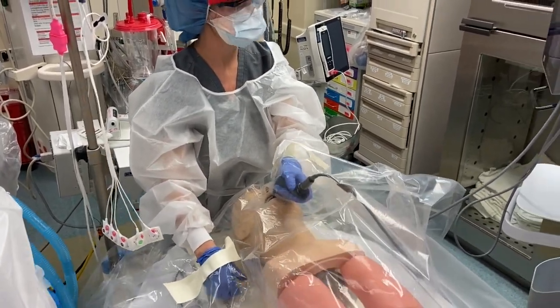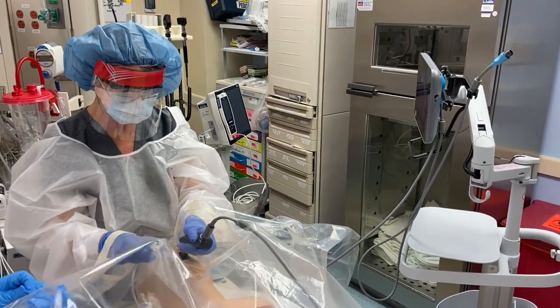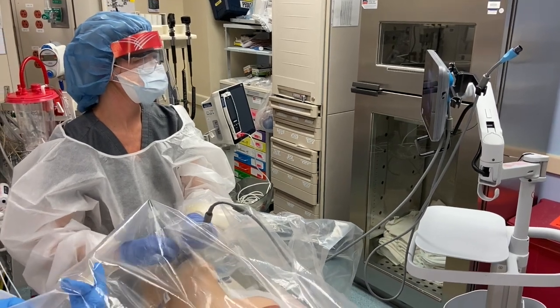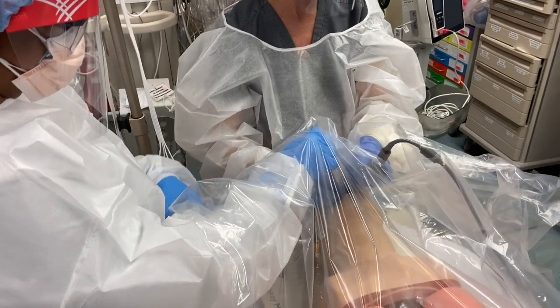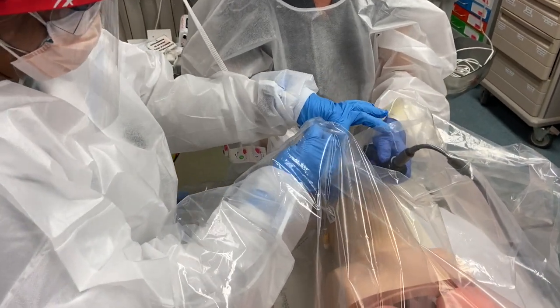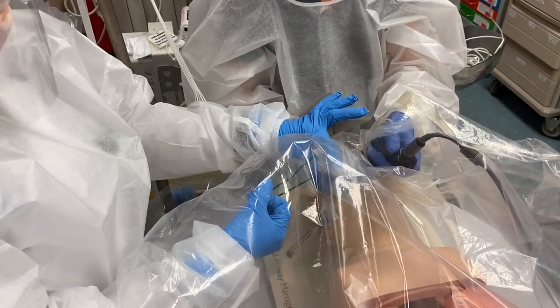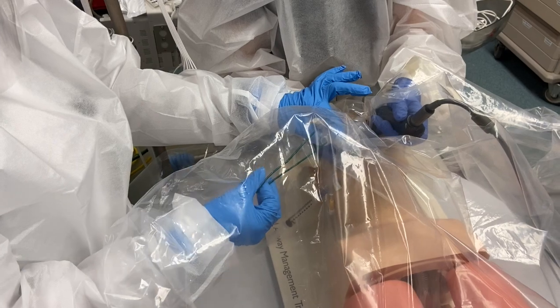Underneath the drape, the respiratory therapist will hand the operator the ET tube. Notice during this time, the video portion of the laryngoscope is kept away to avoid contamination of the laryngoscope. The respiratory therapist continues to assist with the intubation, removing the stylet with one hand underneath the drape and one hand over the drape, also to reduce contamination.